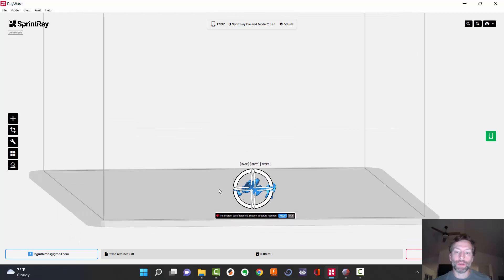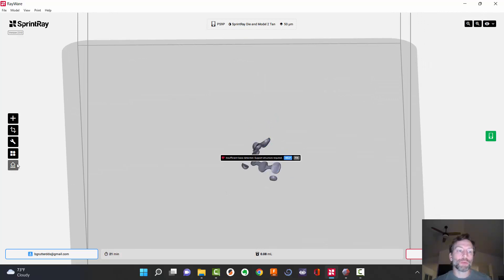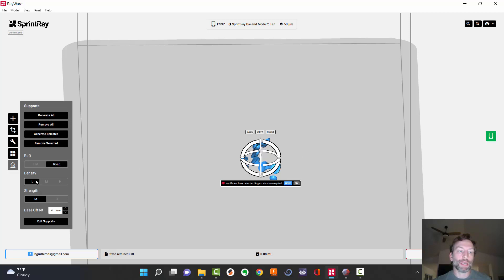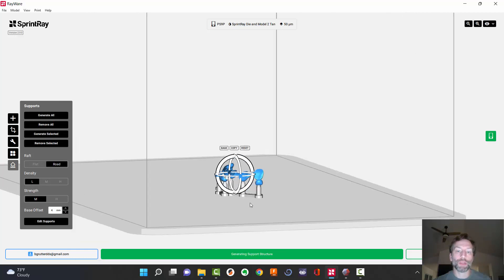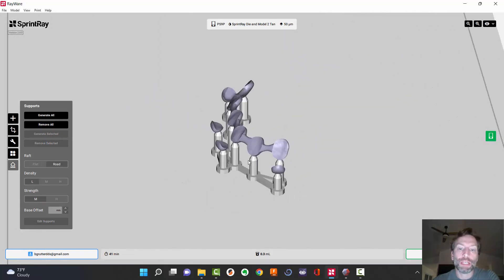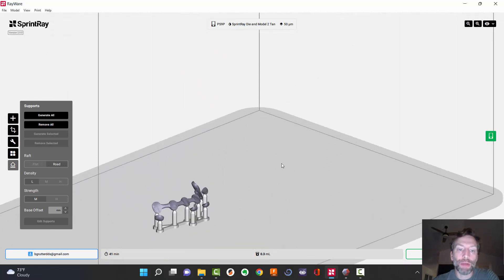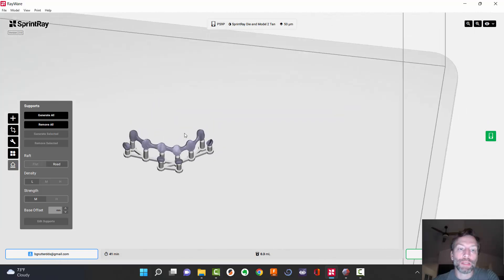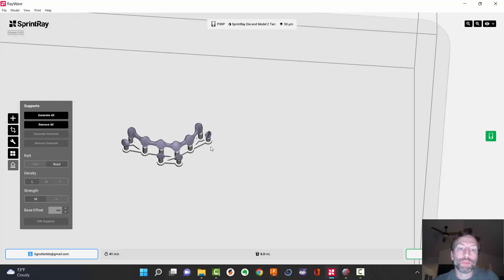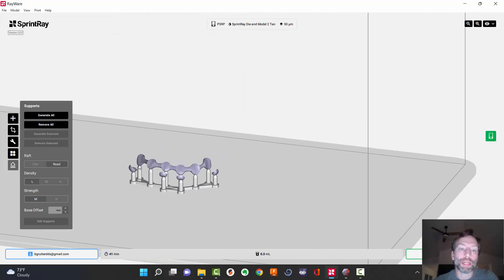We've got this inverted — I want it just like this. Now I'm going to come over here and add supports. I want low density, medium strength, on the raft. I'm going to say Generate Selected. Here we have it. I can print this off, pop this off keeping it all intact. I can insert it into the patient's mouth as is. All I have to do is place cement here, here, here, here, here, here. These rest seats will keep it nice and intact, everything interlocked together. Now all I have to do is go back and clip off the supports.